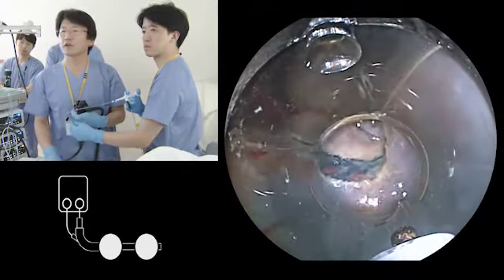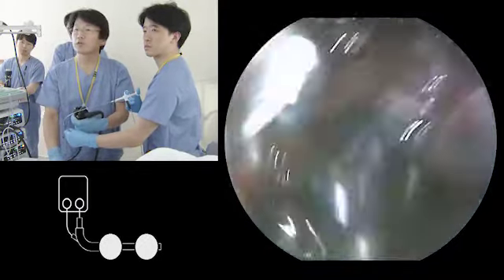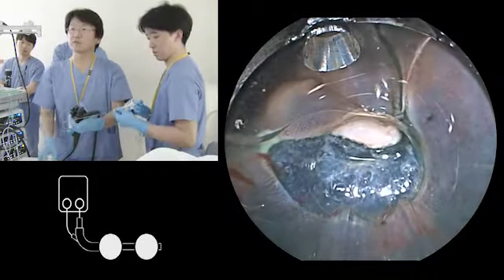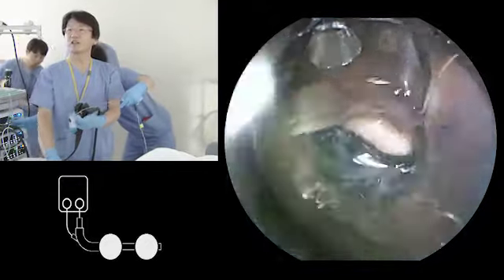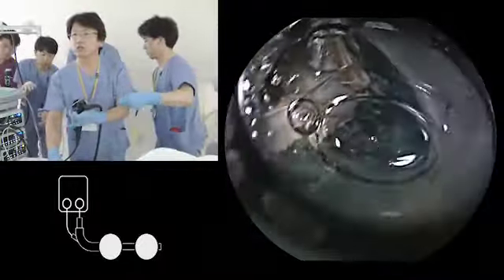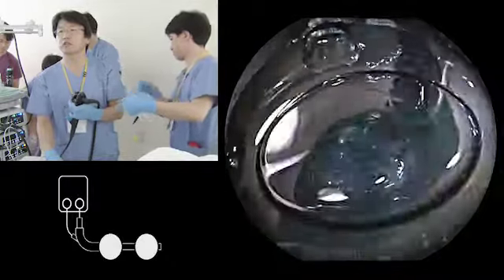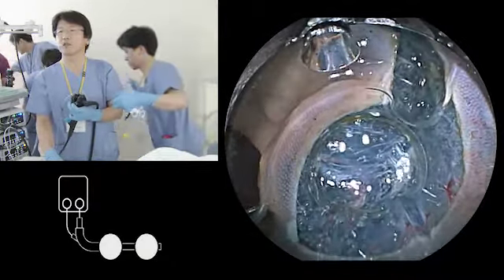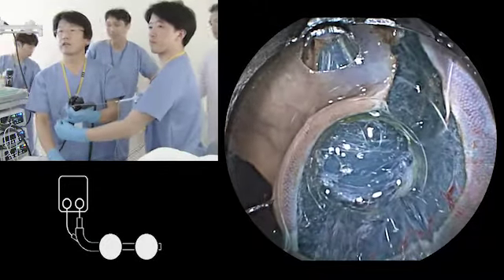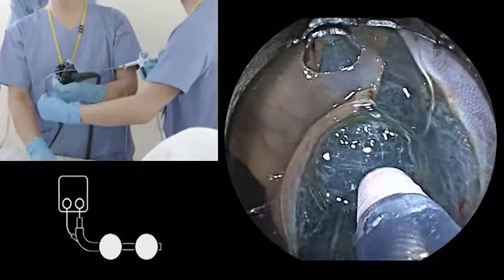So several times of dissection and using the water jet together. Is it water jet? Two or three maybe. And then I can go in using the ST hood. I can go into the submucosal space easily, like this. Okay? Then I can slowly go deeper.